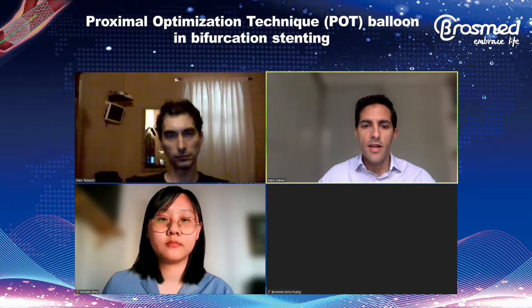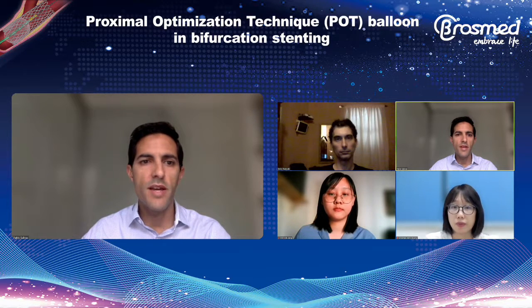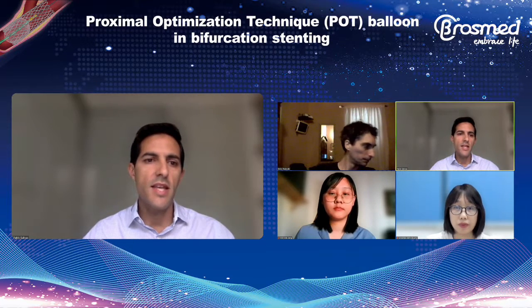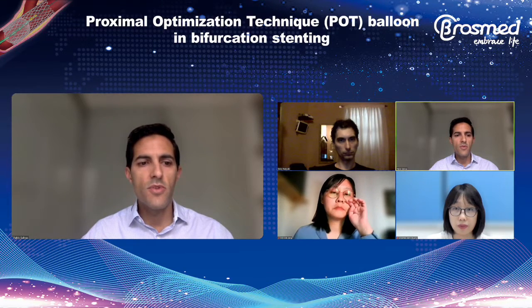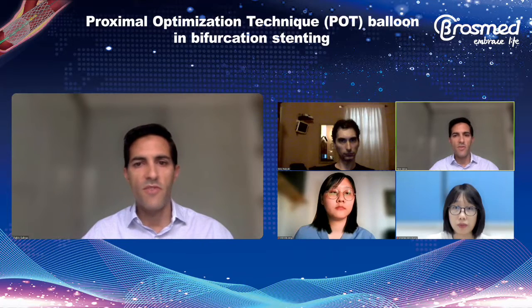I think we had today a very nice webinar. In the introductory talk, we learned the rationale and technology behind this balloon. The first talk described the principles of POT, or how to adapt distal stent size to the proximal vessel size at a bifurcation. Stents also usually elongate, as Dr. Toth beautifully showed us, and you have to know your stent platform to know its overexpansion performance.